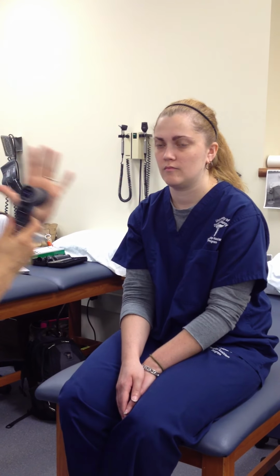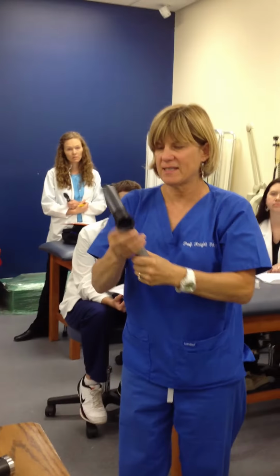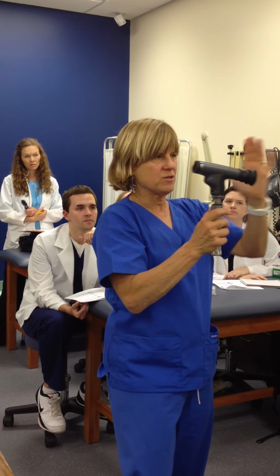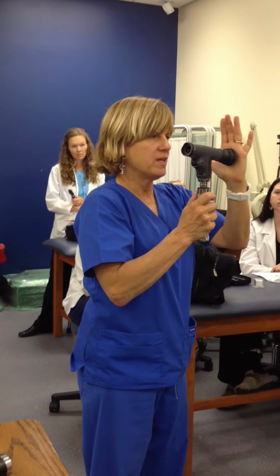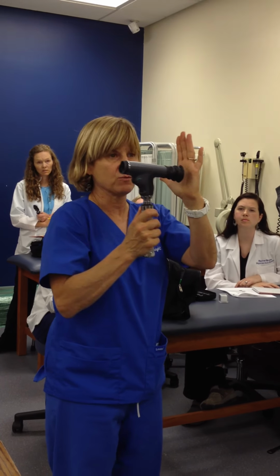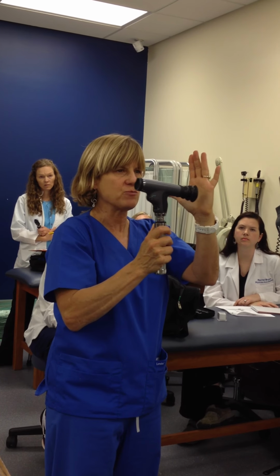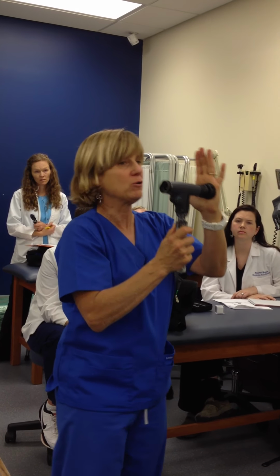Okay. You do kind of want to collapse this thing ideally. So when you're practicing these, I don't use these as much. I had it, her right eye, I wasn't so good on her left eye. I drove it in, and right away I could see everything. It was perfect circle. And then I collapsed. I didn't get it as collapsed because I was a little nervous about losing it.